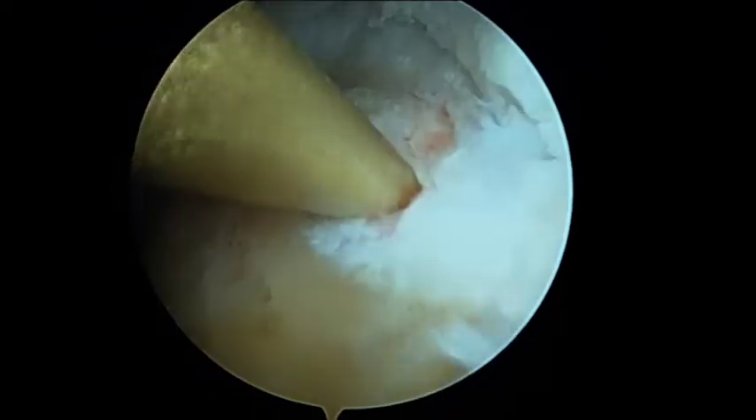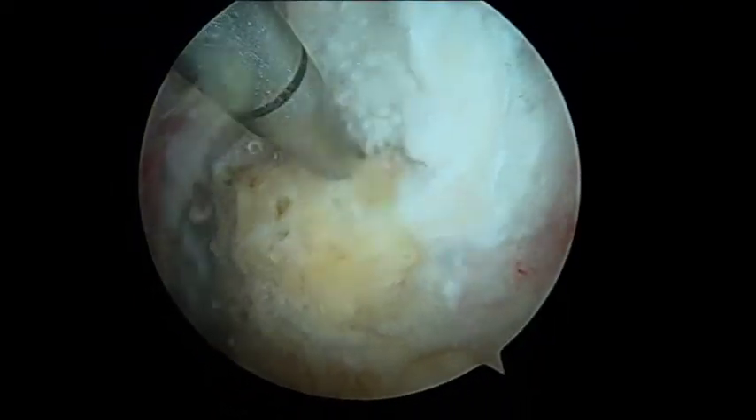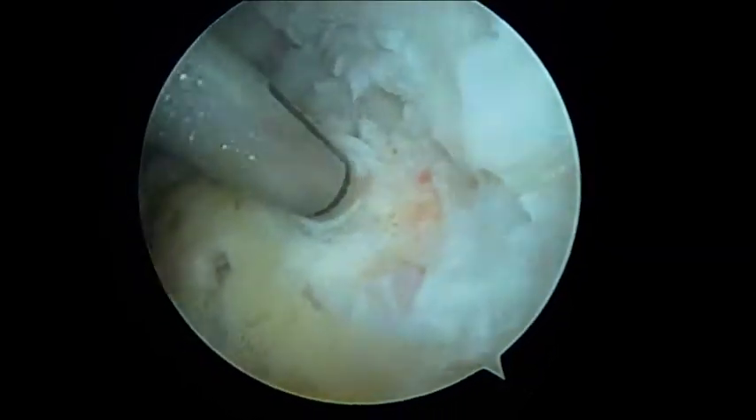Bone marrow vents may be placed at and around the footprint to stimulate a cellular response. A triple-loaded, helix-advanced, 5.5mm peak suture anchor with ortho-cord is placed at the most medial margin to create the medial row.